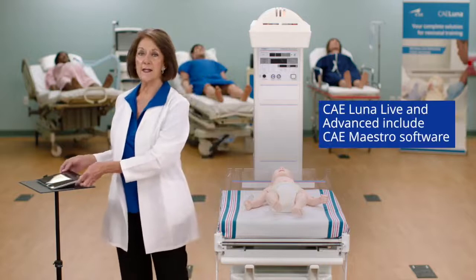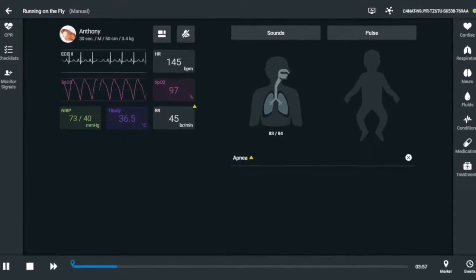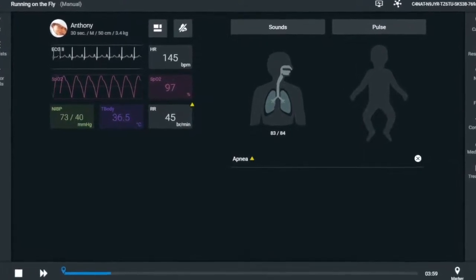With Luna Live and Advanced, a tablet is included that provides access to our intuitive, user-friendly software, Maestro.